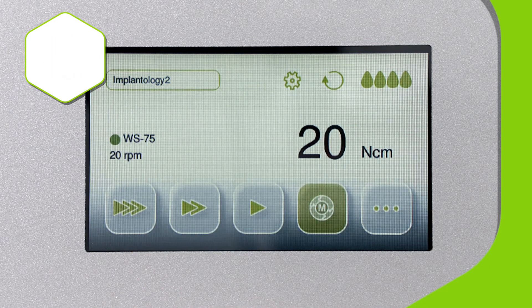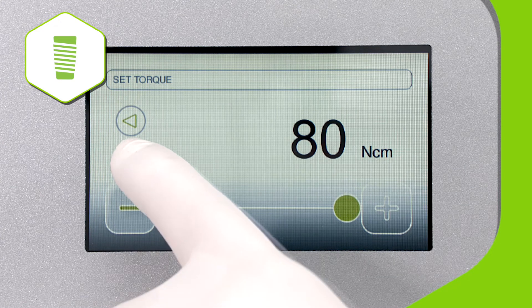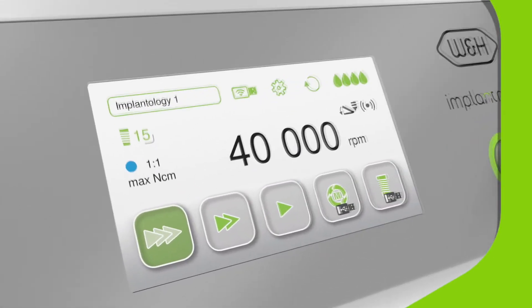And of course, the ImplantMed Plus supports controlled implant insertion of all kinds with torque of up to 80 Newton centimeters. So there you have it — a fully multifunctional system.